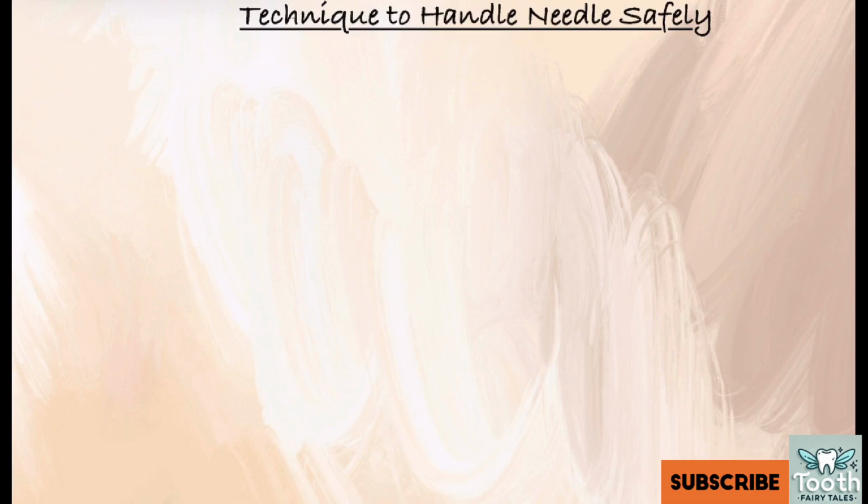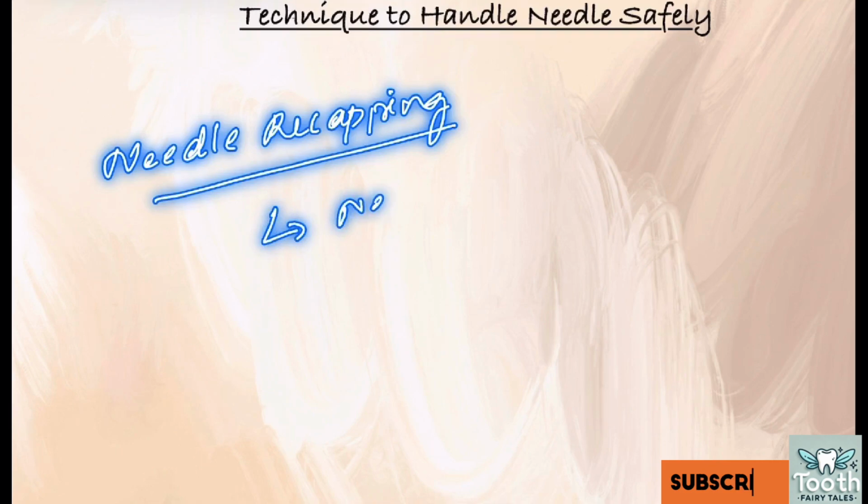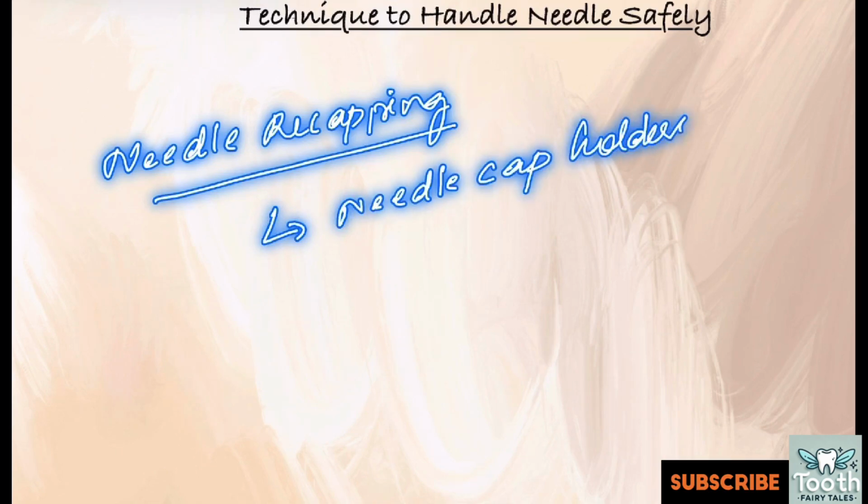There are some other devices, which are known as needle recapping devices, which include needle cap holders and syringe holders.